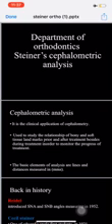محاضرتنا اليوم Steiner Cephalometric Analysis. Cephalometric analysis is the clinical application of cephalometry. This is used to study the relationship of bony and soft tissue landmarks prior to and after treatment, besides during treatment, in order to monitor the progress of the treatment.